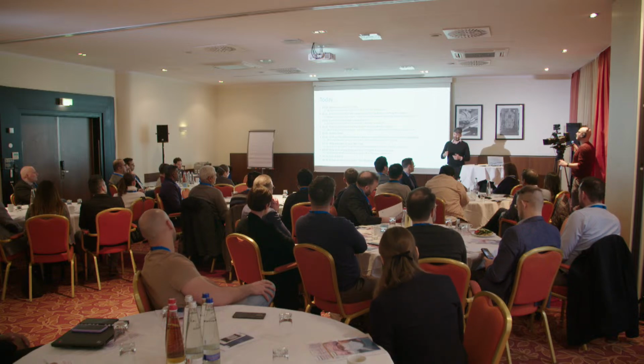We'll try and keep it as informal as possible with the microphones moving around, and the next two days are not just us talking to you. It should be as much of a discussion as possible, because believe me, we learn as much from you guys as you learn from us. We're not really here to sell you IVUS. I think the information you get from it sells itself, but what we are here for is to teach you how to use it if you haven't used it already.